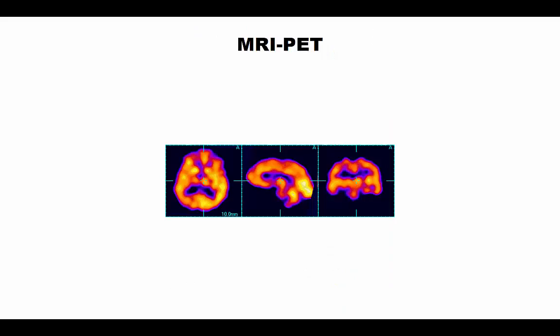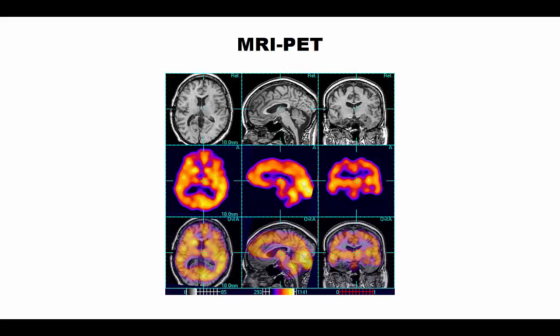Previously we have seen PET is a good molecular imaging technique, but its spatial resolution is not so good. While X-ray CT has been used with PET for anatomical mapping, now MRI can take over to give better information for the soft tissue part. Due to the technical difficulties with the requirement of a high magnetic field in MRI, this is a cutting-edge new technique being introduced to the scientific field.